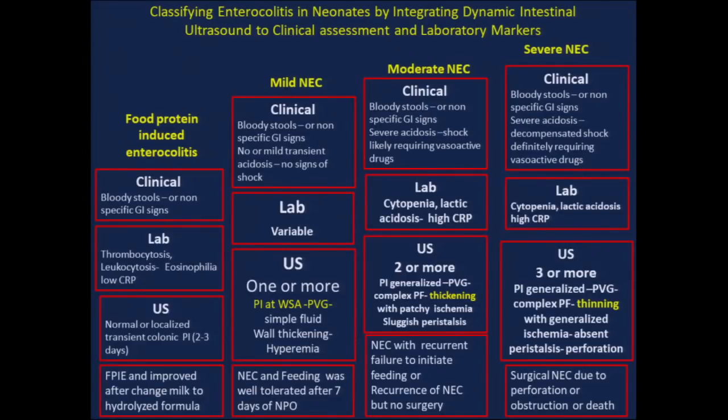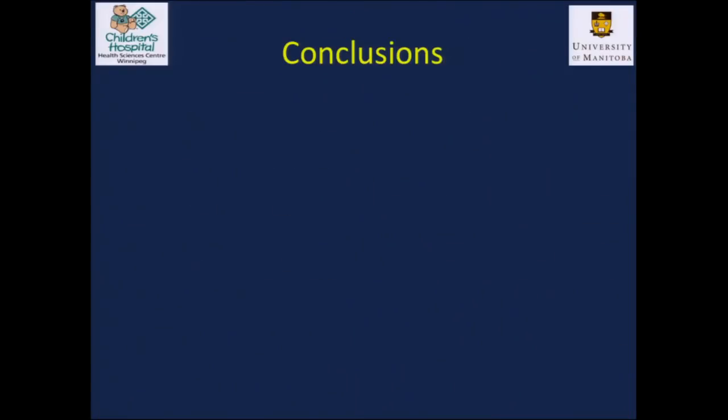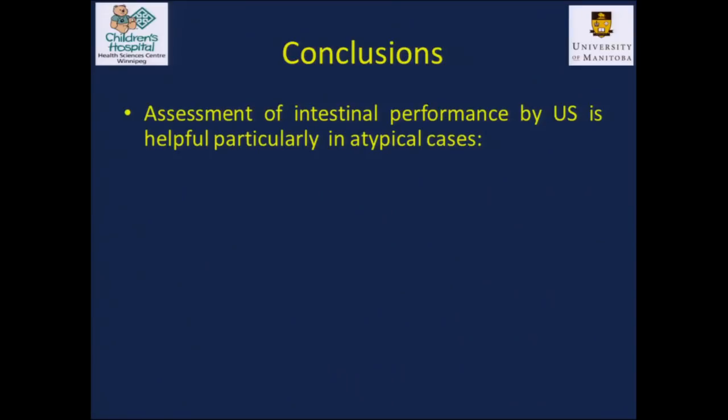So that's the classification that we are working on now. Hopefully it will be published soon. A classification relying on the ultrasound with more specific findings, plus clinical plus lab work. So we took out the X-ray from the classification, and we relied basically on the ultrasound. So to conclude my presentation, assessment of intestinal pathology by ultrasound is helpful, particularly in atypical cases.